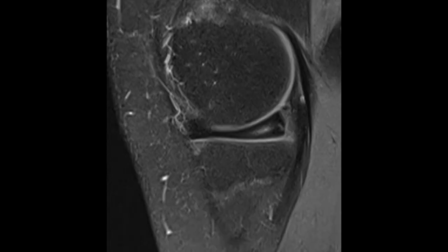The sagittal view shows an enlarged posterior horn with intermediate signal that does not communicate with the articular surface and therefore does not meet radiological reporting criteria for a meniscal tear.